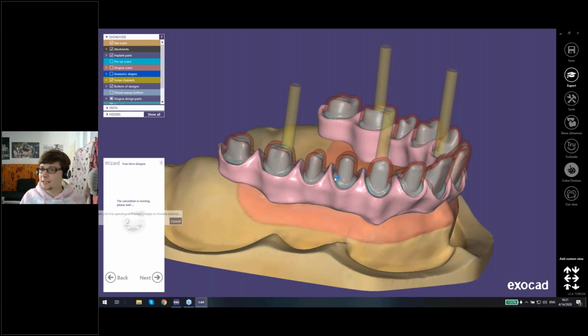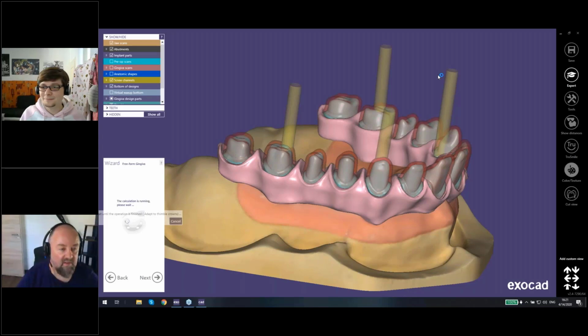Are there already any questions that we would like to answer? Yes. Okay, Lucas. I was just going to mention the question that says, what happens if the screw channel goes through the margin or is at the margin level? Does that cause a problem?